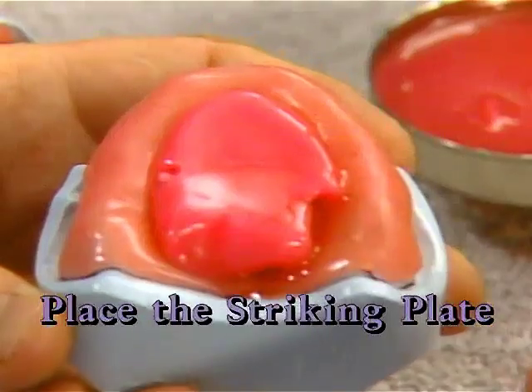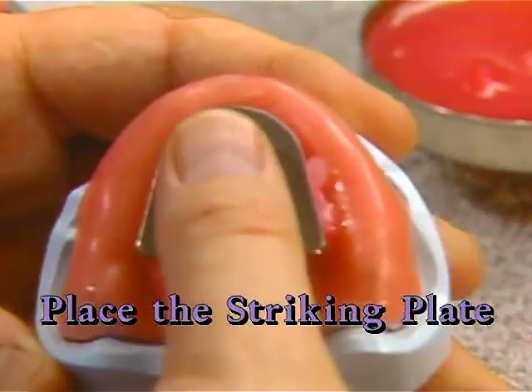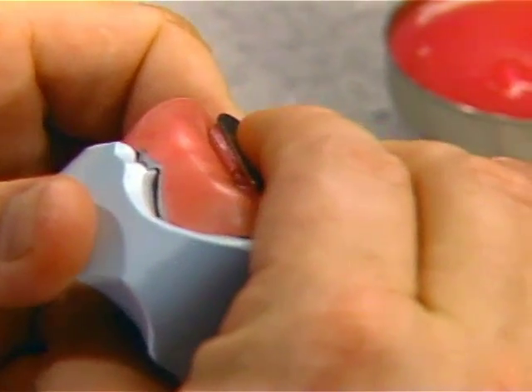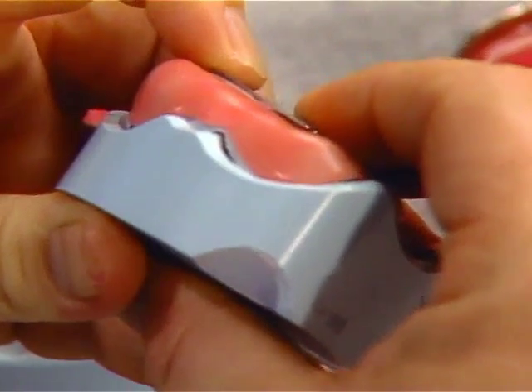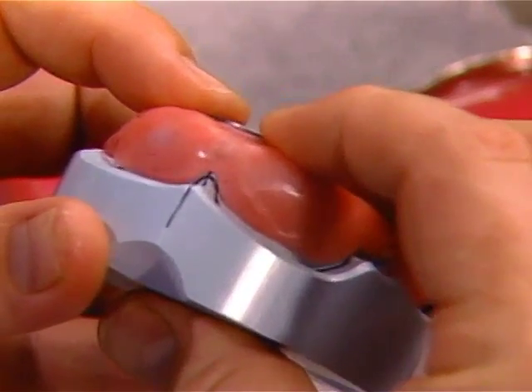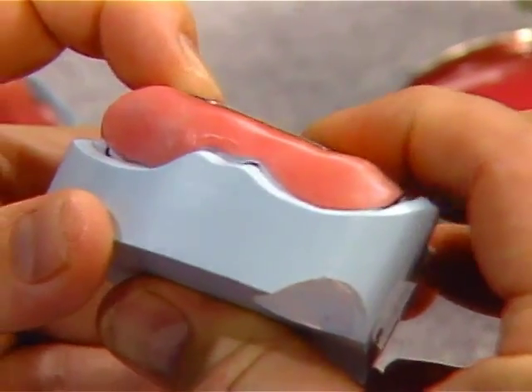Place the striking plate on the soft wax. The plate should be just lingual to the crest of the anterior ridge. If it extends too far forward or backward in the arch, center it. Press the striking plate into the soft wax until it is level with the crest of the ridge. Viewed from the front, the plate should be level in the vault. Viewed from the buccal, the plate should have a slight tilt upward in the back.